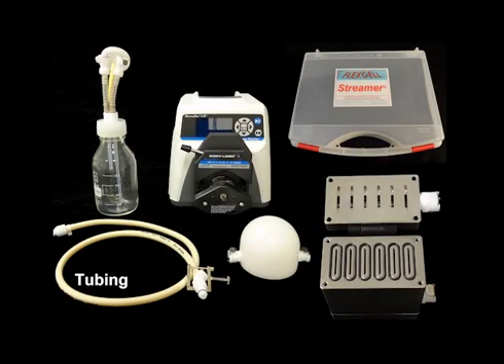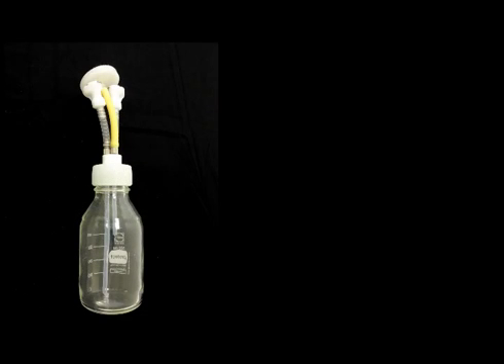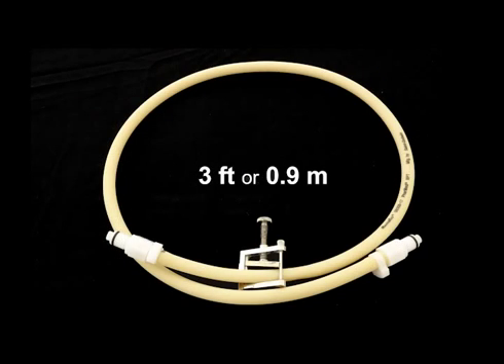Next, we'll connect the tubing. Ensure that the figure 8 tubing that comes with your Ossiflow is inserted into the pinch clamps as shown here. First, connect the medium collection reservoir to the first pulse dampener with the 3-foot-long piece of beige FarmMed tubing.